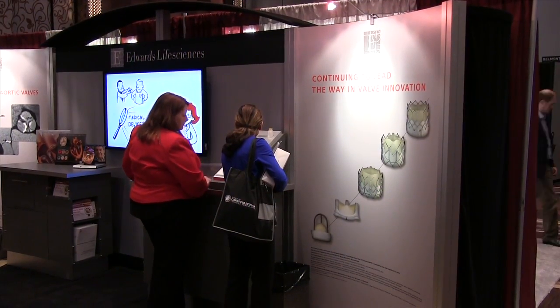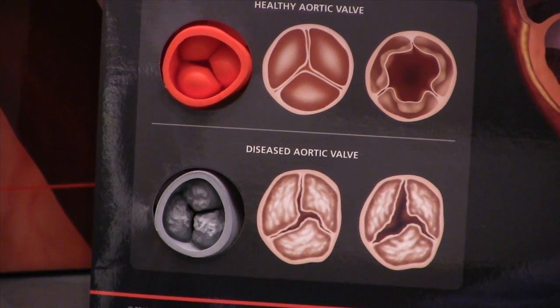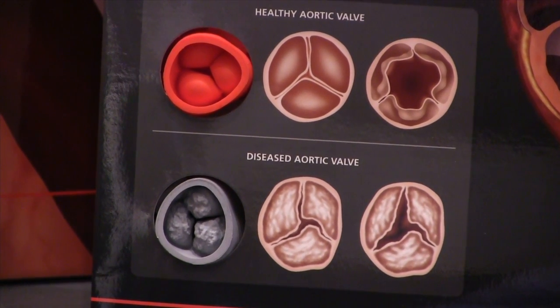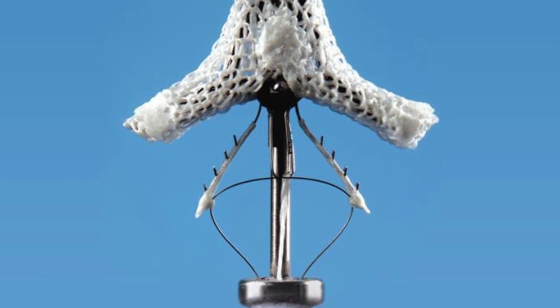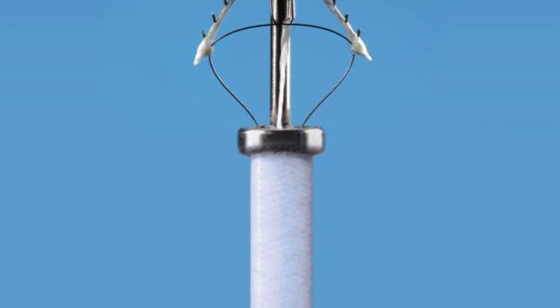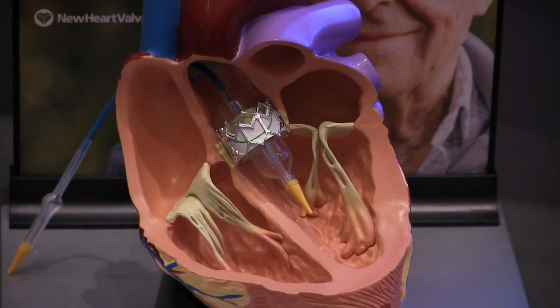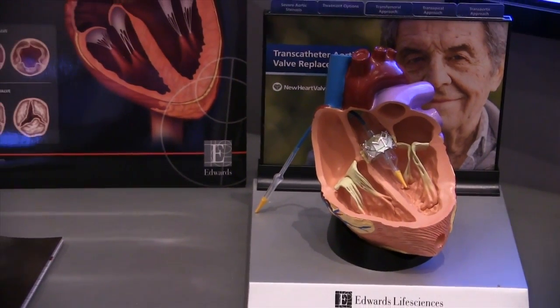One of the trends I've seen at several shows over the last year is the interest of device companies in the imaging modalities used to image them. At ASE earlier this year, Abbott was demonstrating its MitraClip device, which is used and imaged exclusively in the interventional lab under TEE. At SCCT 2015, Edwards is displaying for the first time, highlighting its transcatheter valve technology.